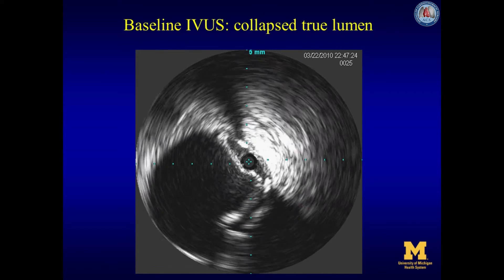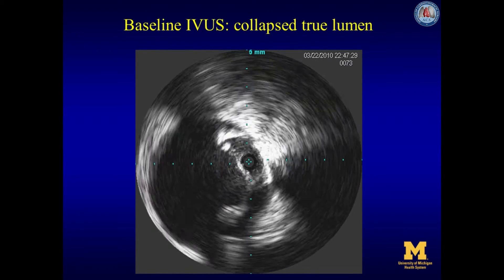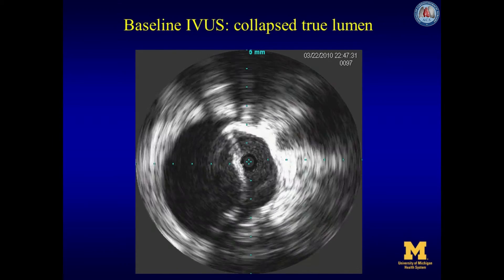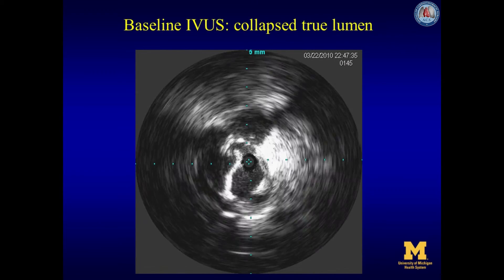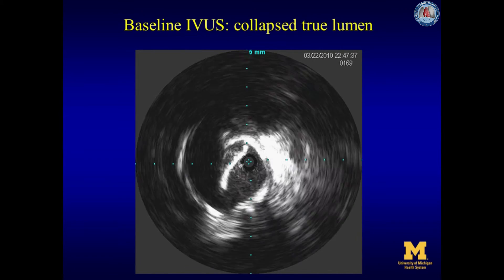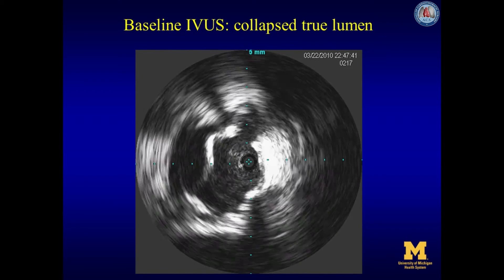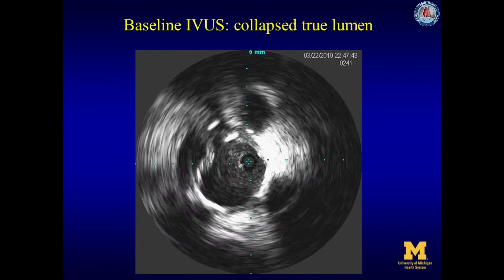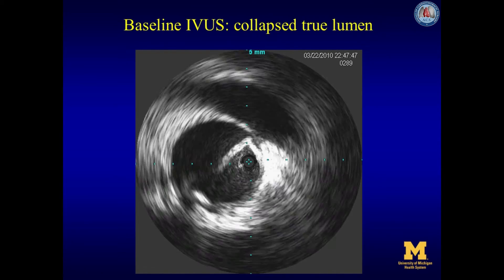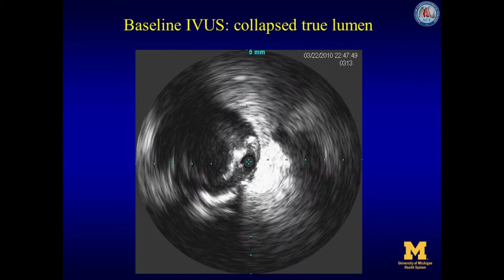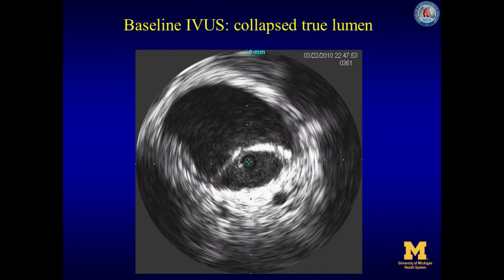A focused IVUS better oriented on the visceral segment shows the celiac artery coming off with the collapsed true lumen at 12 o'clock. The superior mesenteric artery comes off at 12 or 12:30 from the collapsed true lumen. The left renal artery comes off at the right side of the screen with the renal vein crossing the front of the aorta. The infrarenal aorta also shows a collapsed true lumen.